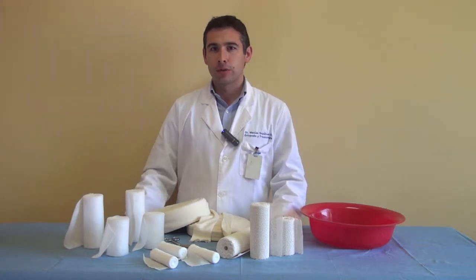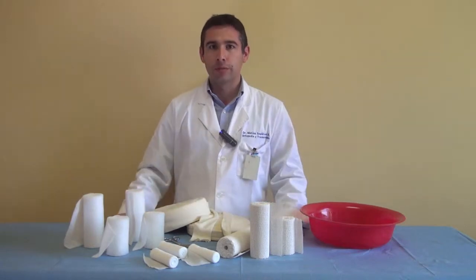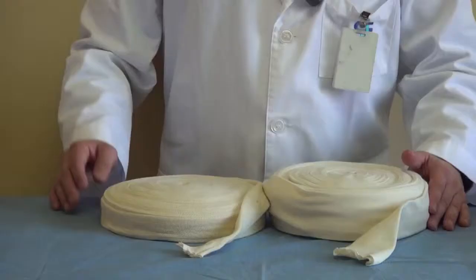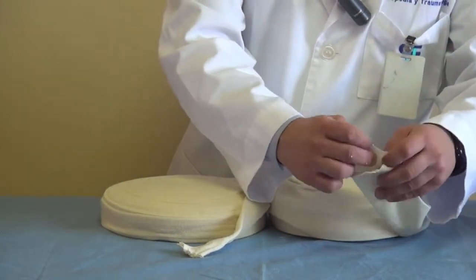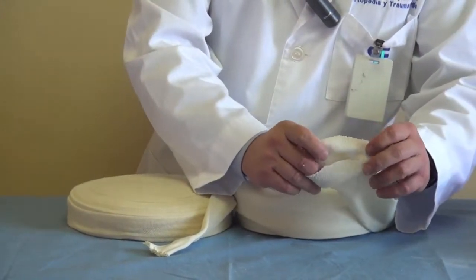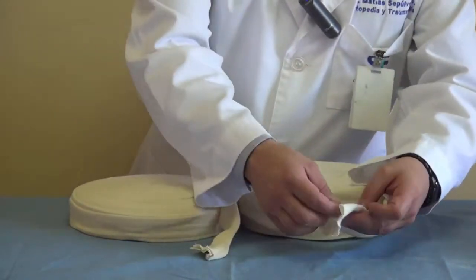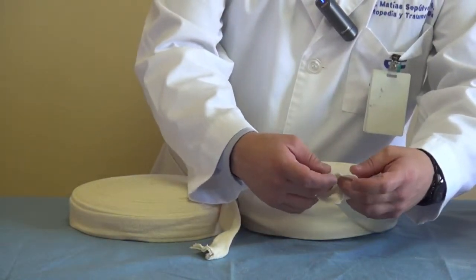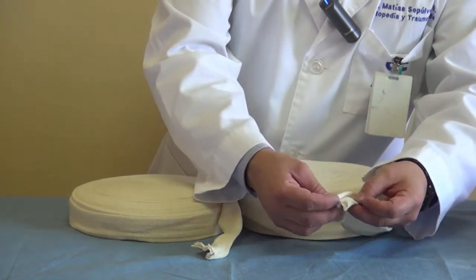Now we're going to show how to make the cast. First we need to see which materials we're going to use. The first thing to do is apply a tubular stocking to protect the skin from the materials. This comes in different sizes so it's not too tight but also not too loose, in order to avoid wrinkles.